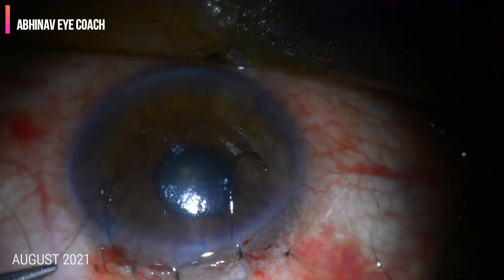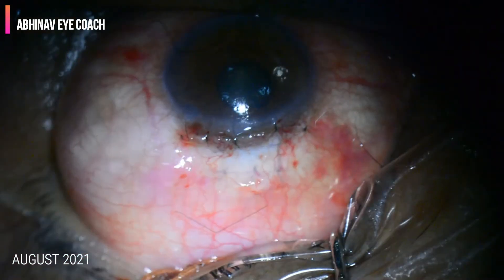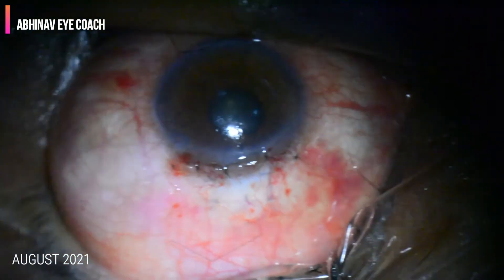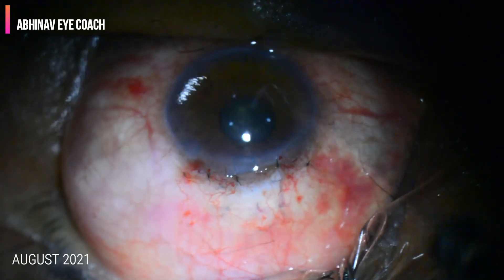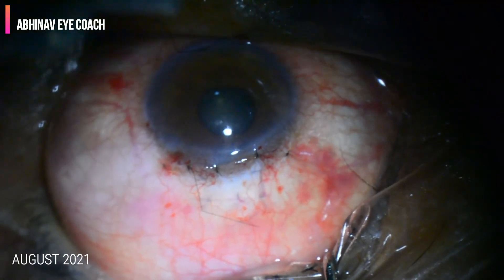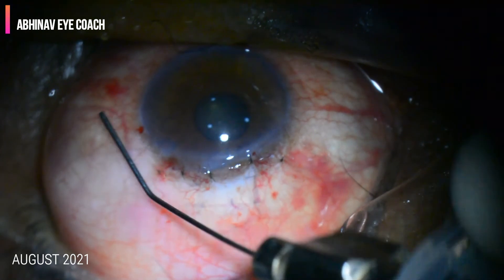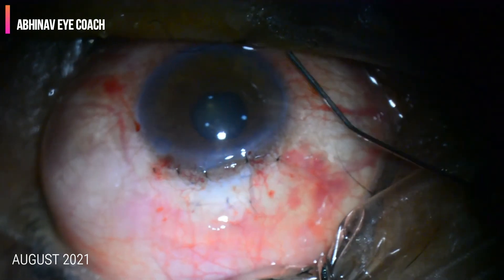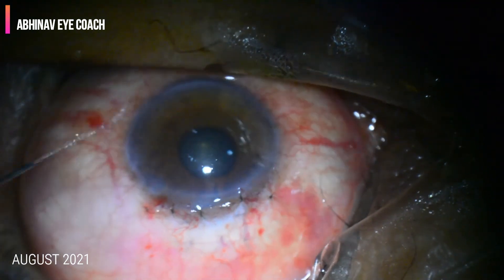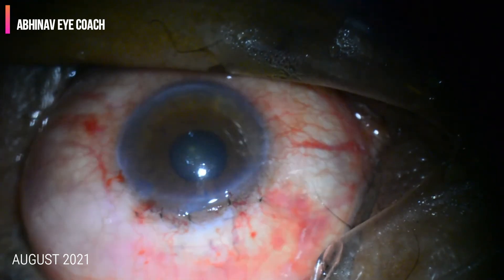The conjunctiva is closed watertight with the help of 8-0 Vicryl or 10-0 nylon. The conjunctival closure should be watertight. The anterior chamber is formed and checked for any leakage. Antibiotic eye drops are applied and a subconjunctival injection of cefuroxime is given. The eye is patched and the patch is opened the next day.